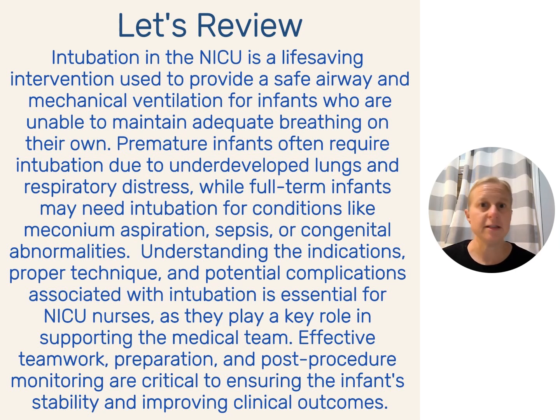I do not intubate. I am not certified to intubate. I've never gone through a training or done any special course for that. So this is an overview from kind of a bedside nurse's perspective. What would be expected of you to be doing during intubation?